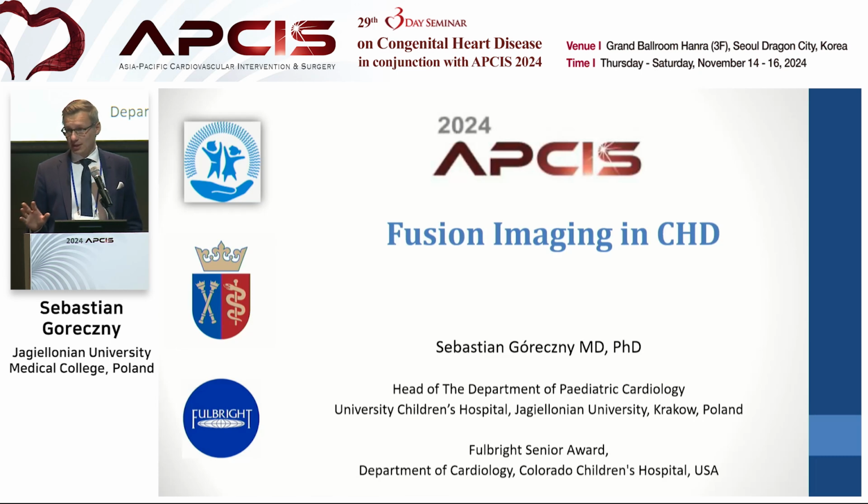I will try to combine two subjects. One is fusion imaging, that what you asked me first to present, and then to try to find benefits of not only this way of imaging in the cath lab.